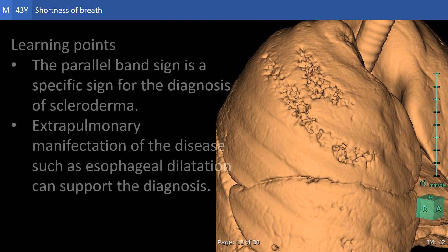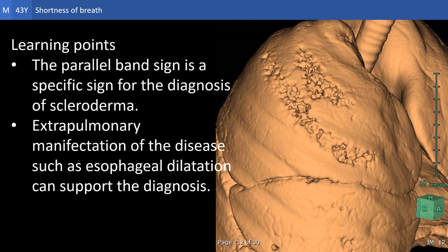We have learned also about the parallel band sign as a useful sign for the diagnosis of scleroderma and have seen the mechanism by which it is produced. We have seen also that the extrapulmonary manifestations of the disease, such as esophageal dilatation, can support the diagnosis on CT of the chest.